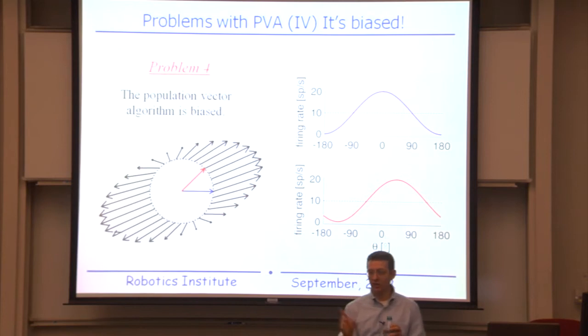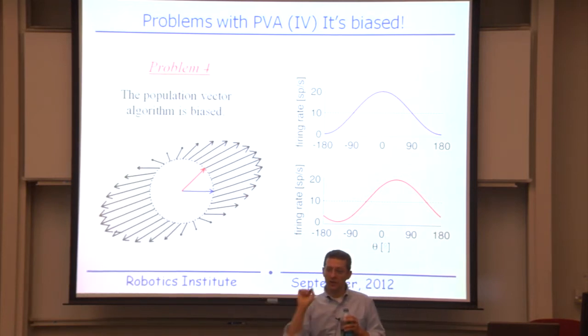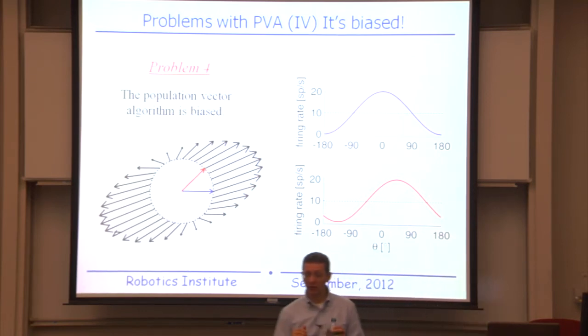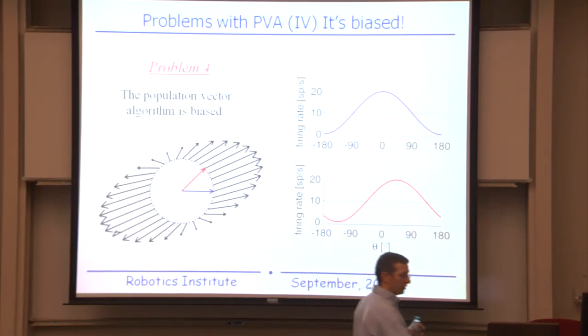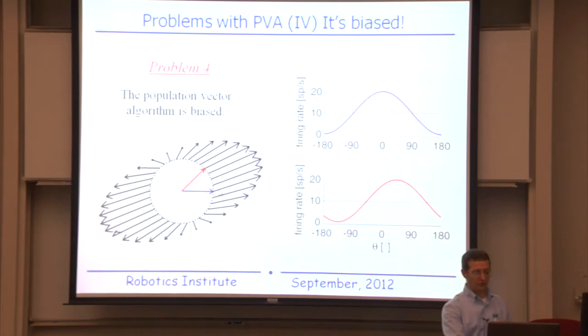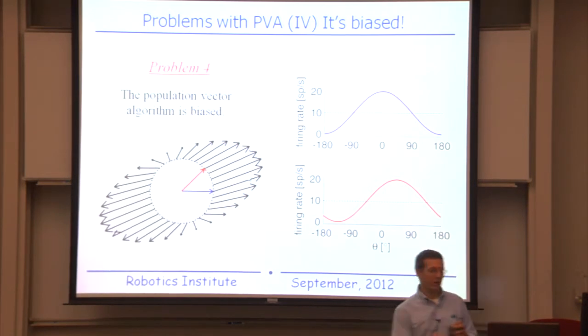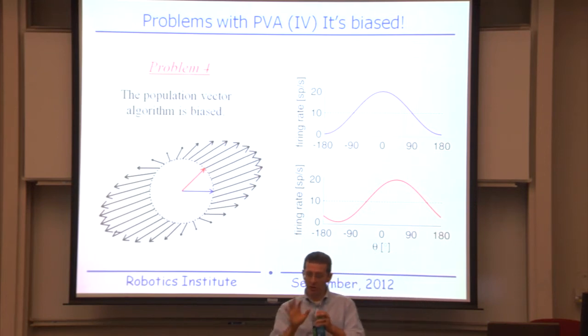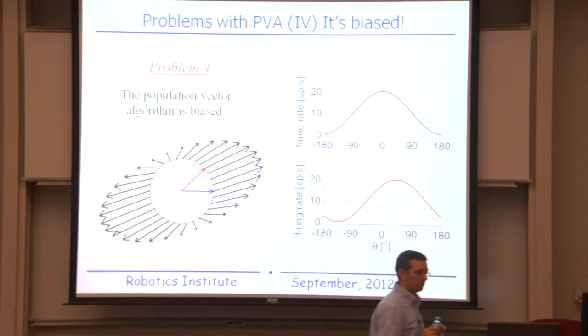Now, when the subject is trying to aim directly to the right, he's going to activate that first neuron. It's going to fire above its baseline firing rate, because that's in that neuron's preferred direction. He's also going to activate the second neuron, because it's close to that neuron's preferred direction. Both of them are going to have positive contributions to the population vector average, and the resultant movement is not going to be directly to the right, but a little bit up and to the right. You can play this game, assuming he's trying to aim at points all the way around that circle, and what you get is that the movements that actually result tend to be clustered along the axis that describes the majority of tuning curves of those neurons. So it's a biased algorithm.